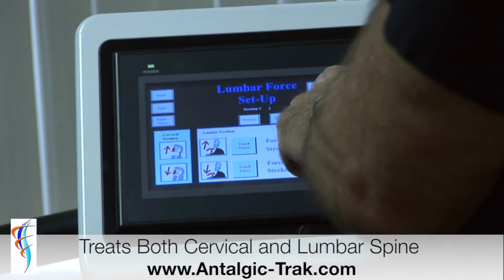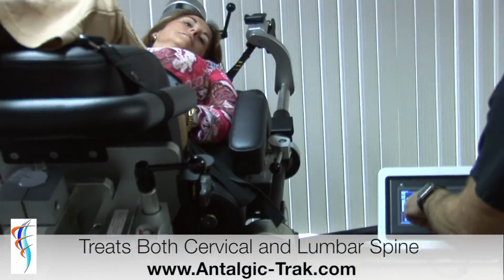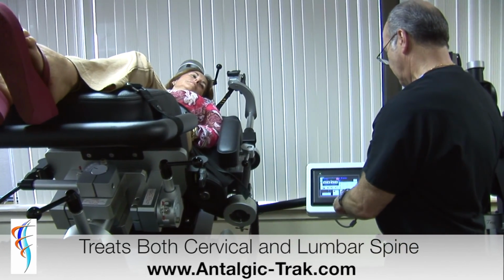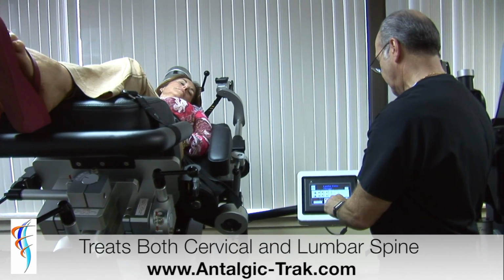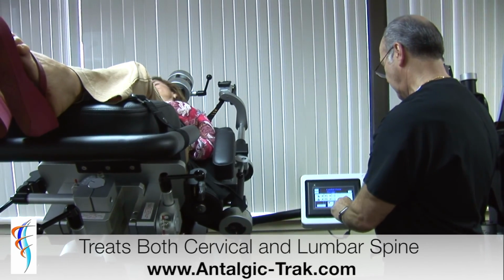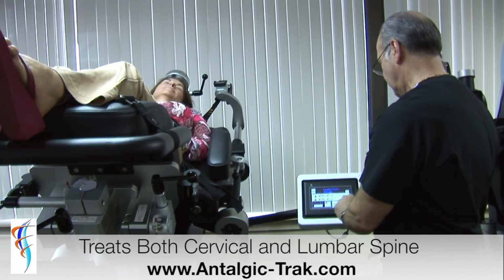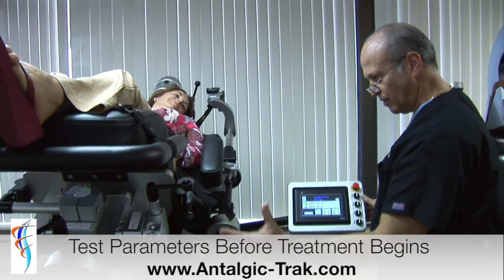I'm going to go to a therapy screen. I'm going to set my time. In this case, we'll just do a 10-minute session. And I'm going to bring the time down, or the dwell time, which I will explain momentarily, to 3 seconds of pull and 2 seconds of release. I use those settings to test the pull and the release.